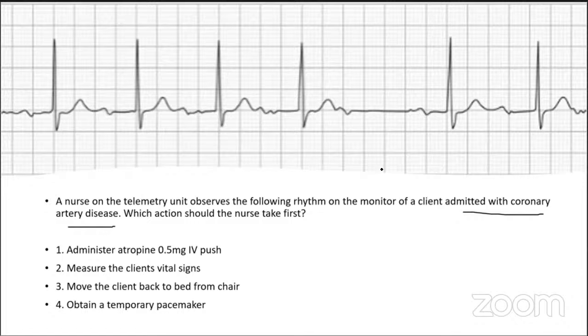Again, like I said, these people just came up here and told you, see how to do it. What should you do? My brother, the first thing you should do as a nurse is always to carry out an assessment. We don't even need to know whether this is first degree or not. And for those who are wondering about the source of these questions, I pay for Kaplan, I pay for UWorld, I pay for Archer, and then I pick the difficult questions and use them as my study materials. Apologies to all of these bodies that put in the effort to draft these questions.